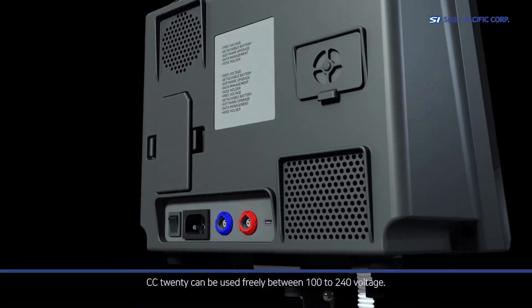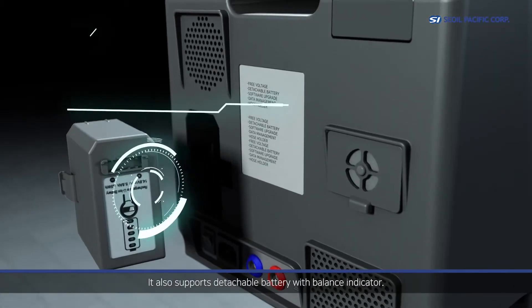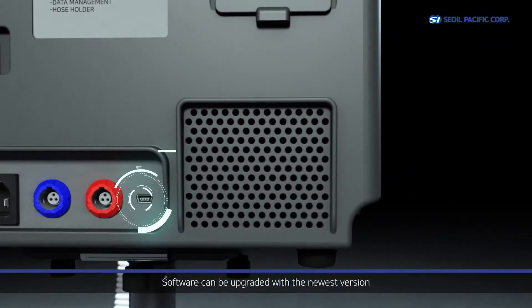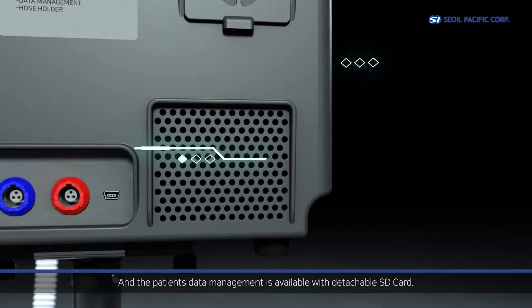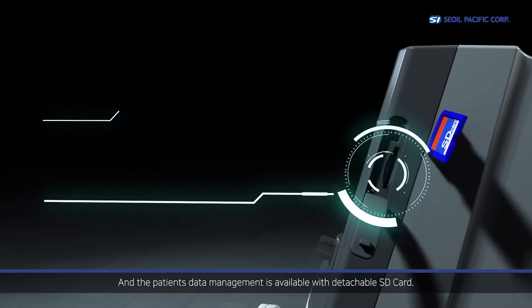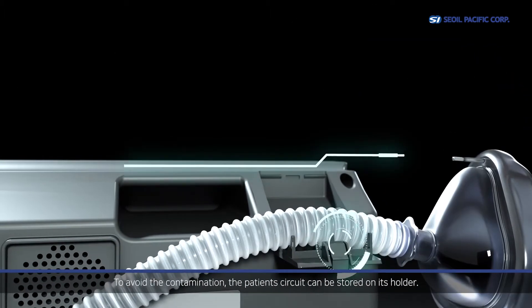CC20 can be used freely between 100 to 240 volts. It also supports a detachable battery with a charge level indicator. Software can be upgraded to the newest version, and patient data management is available with a detachable SD card. To avoid contamination, the patient's circuit can be stored on its holder.